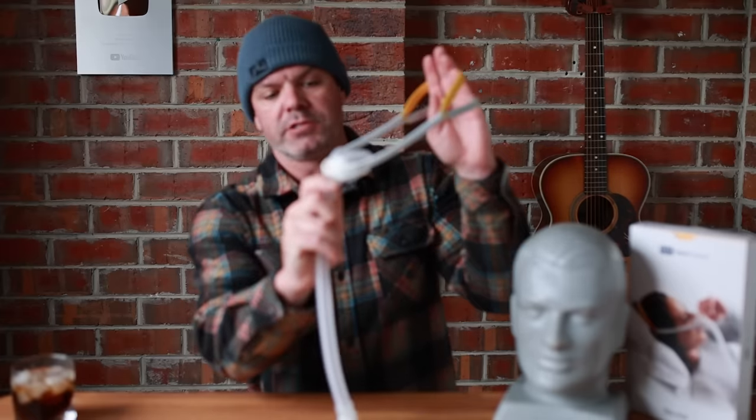G'day mates, happy Sunday. There is a lot of buzz right now around this new mask from Fisher and Paykel, the Solo.